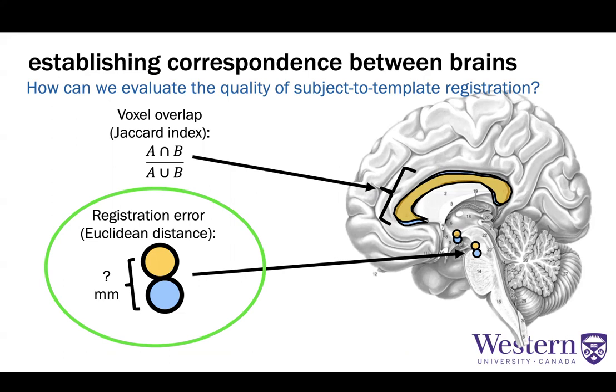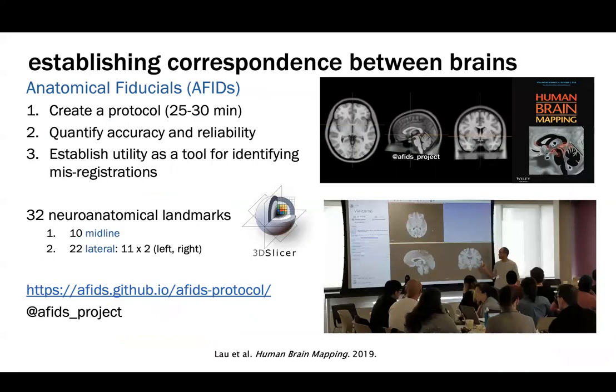And I will emphasize as part of this talk today that we have been underusing the registration error metric, which is a simpler metric, but for a number of different reasons, partly due to convenience, we have found that regions of interest is our go-to because they are available with most of our common neuroimaging pipelines.